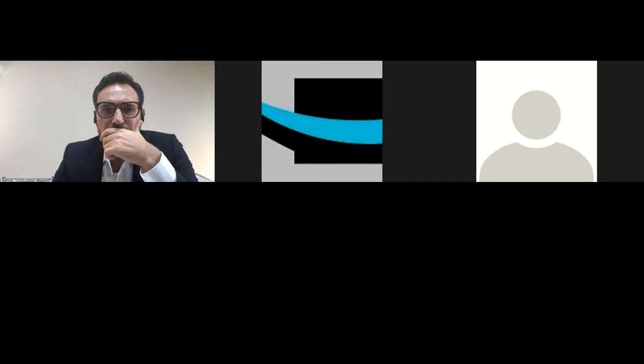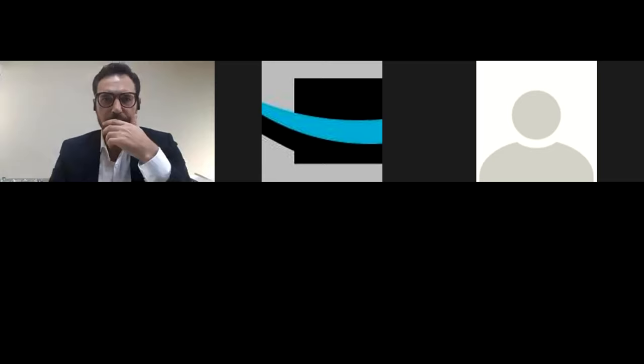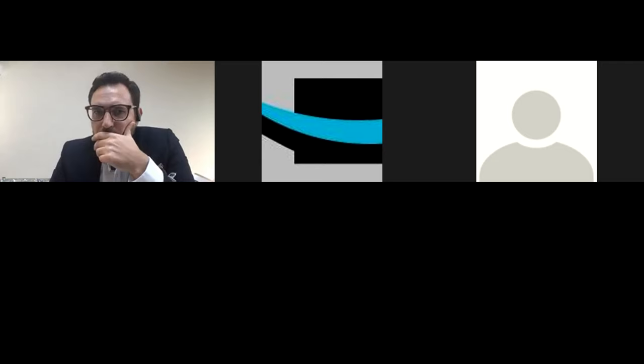I understand the question, but I check the bar. I don't have a model, because in the first phase I don't have a model. So my dental technician produces a bar in the digital environment, on the digital impression. He gives me an aluminium bar, and I check this aluminium bar inside the mouth. This is the most important part of my clinical activity. So I know if my bar is correct or not.